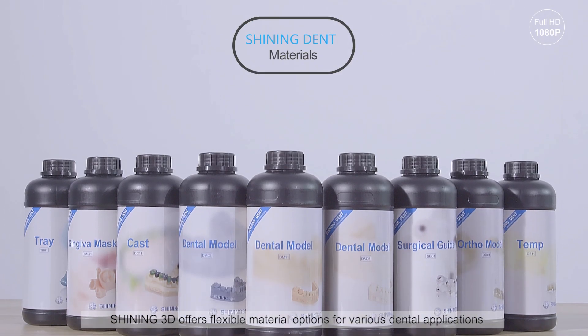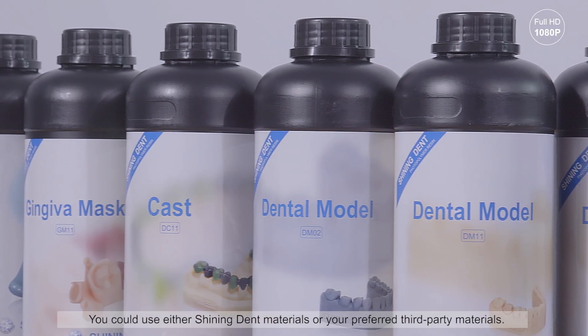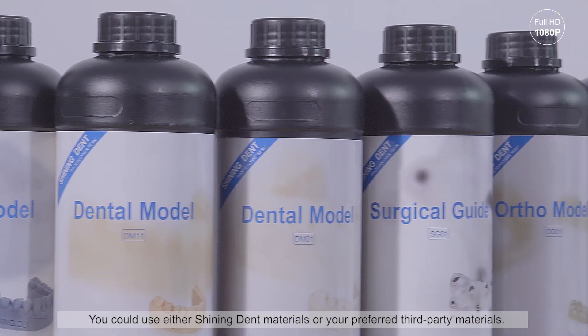Shining3D offers flexible material options for various dental applications. You could use either ShiningDent materials or your preferred third-party materials.